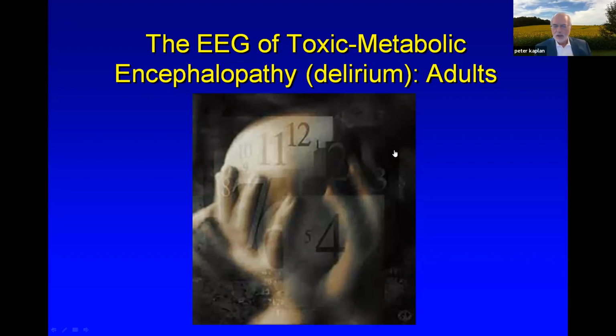All right, so the interictal continuum was a term coined when they realized that patients may start by having a few discharges, but have, let's say, epilepsy and not be actively having seizures. So that's interictal, but very sporadic, all the way to what the other question was, which is you have frequent discharges that can go even faster than 2.5 hertz, let's say 6 hertz. And somewhere along that line, you have to make a clinical decision on how intensively to treat. So that's the continuum that goes from interictal all the way to ictal.